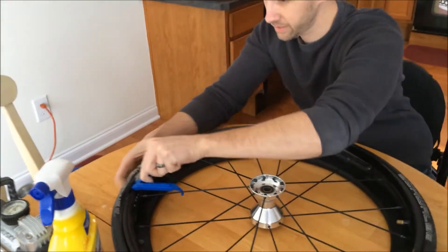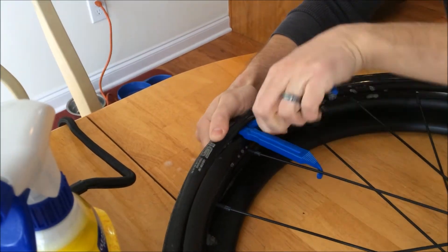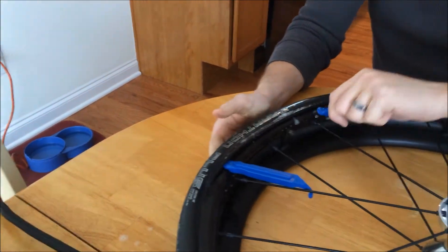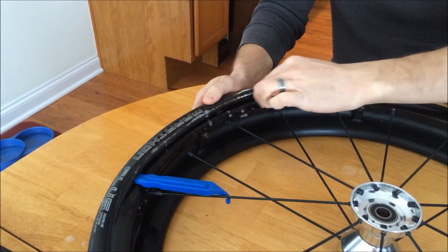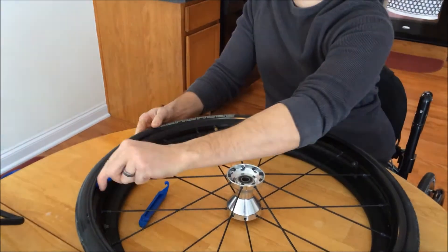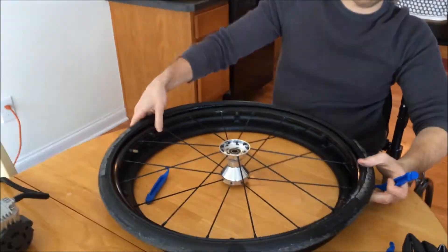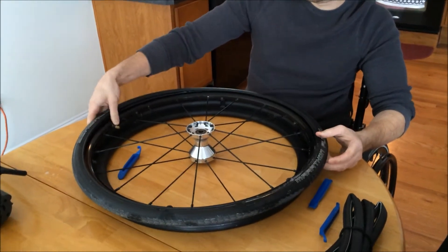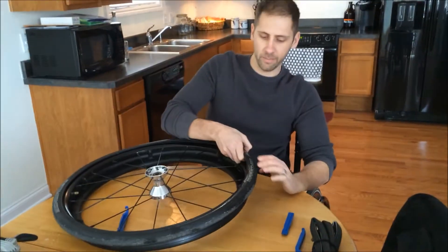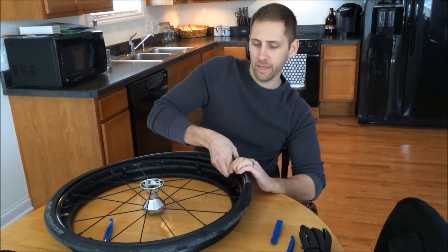So I just kind of stick this in here. It's not exactly the easiest thing to get started — working my way around. At this point it's real easy; you can just slip this all the way around the wheel. Okay, so we've got that back part off. If you were replacing an inner tube, technically you could just stay where you're at right now and pull the inner tube out. I'm going to go ahead and get this tire all the way off the wheel.